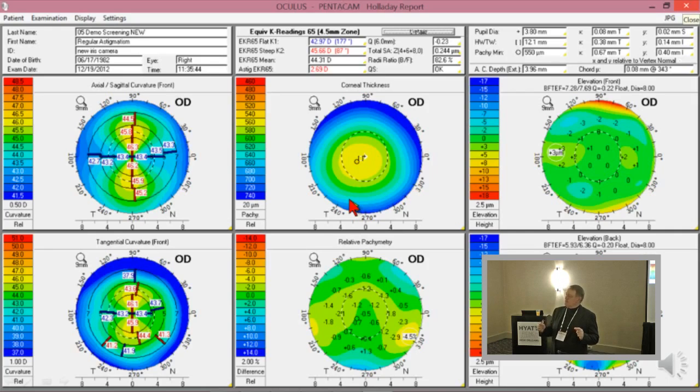And that if you go a little bit further down, it'll be flatter, that'll tip you to where the patient will end up minus a quarter, minus a half.